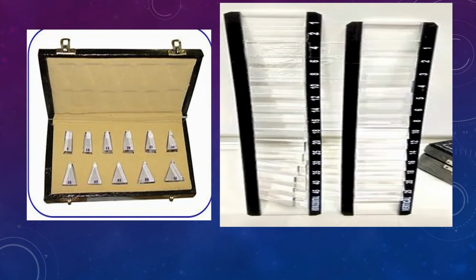Now, for the purpose of prism cover test, either you can use these loose prisms or you can use the prisms which are mounted on a bar, right? So loose prisms are like this. You can actually pick up one prism at a time, put it in front of the patient based on how you're going to put it, based on the type of squint. Okay, that is base in, base out, base up or base down.